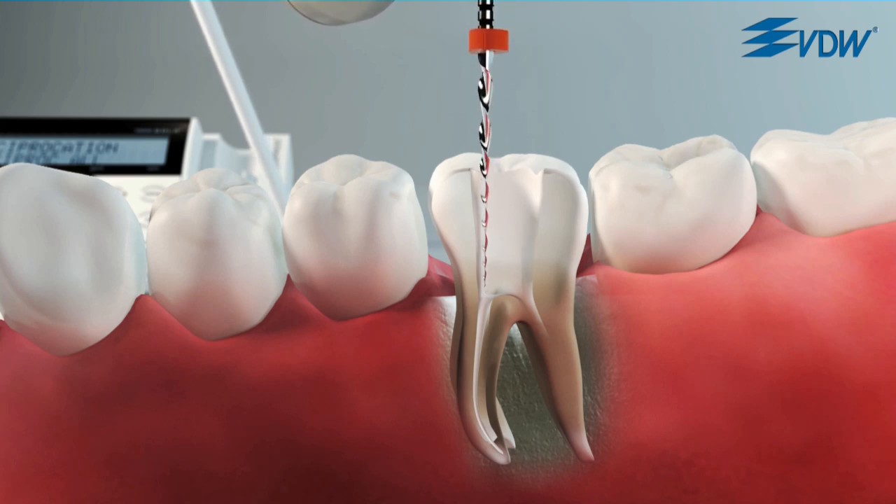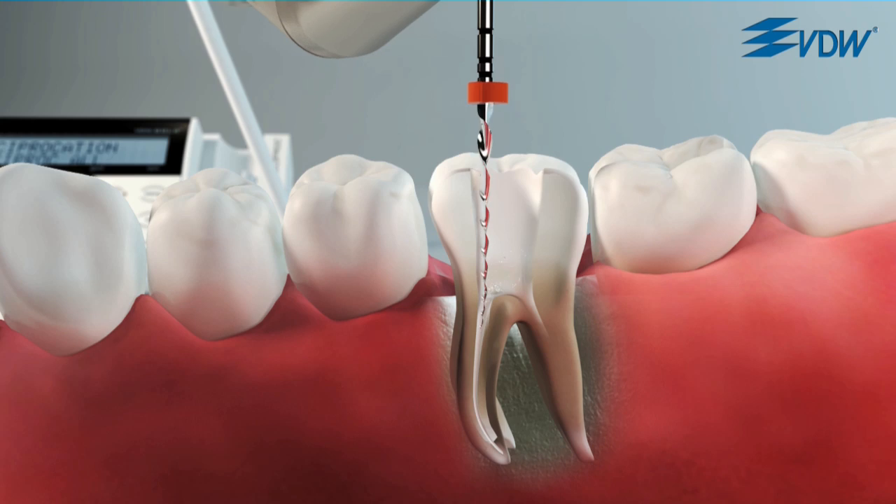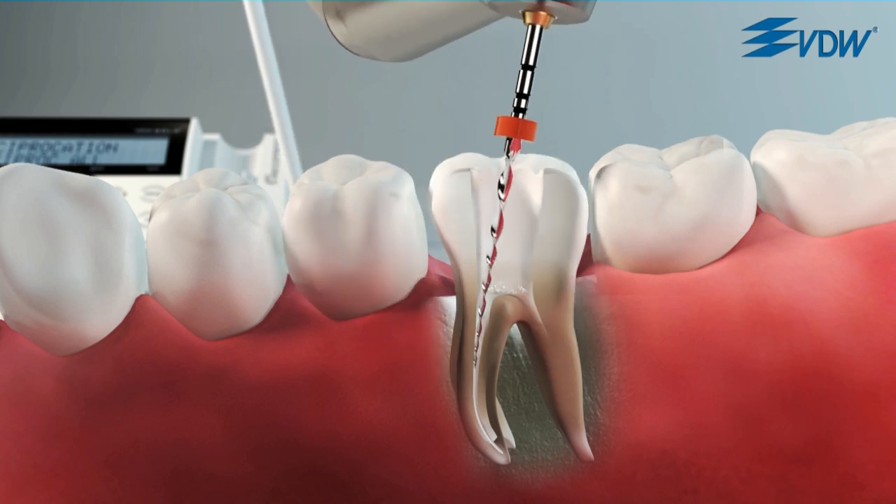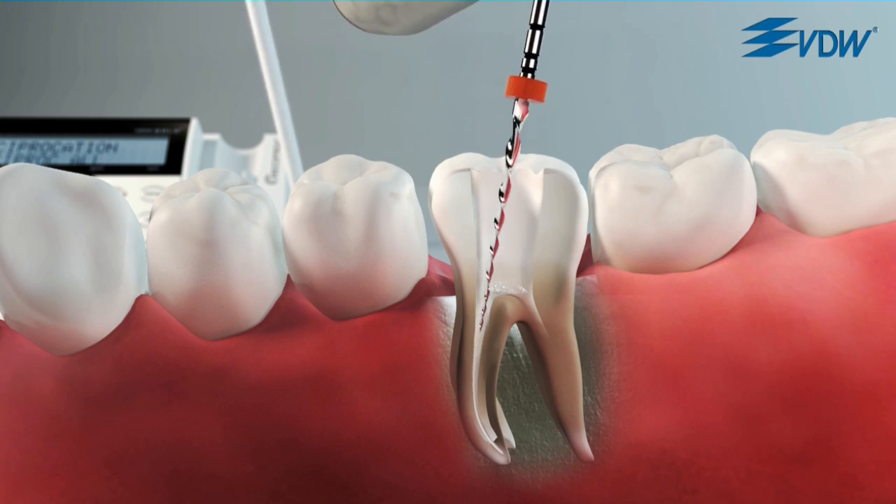Reciproc reverse indicates the need to change preparation movement with two acoustic signals. The first acoustic signal indicates increased stress along the length of the instrument. Use a lateral brushing motion towards the coronal section in a coronal direction to enlarge the root canal.